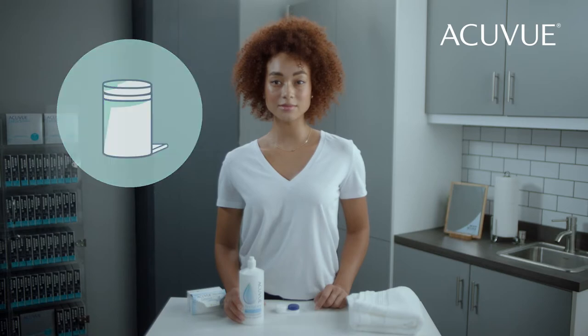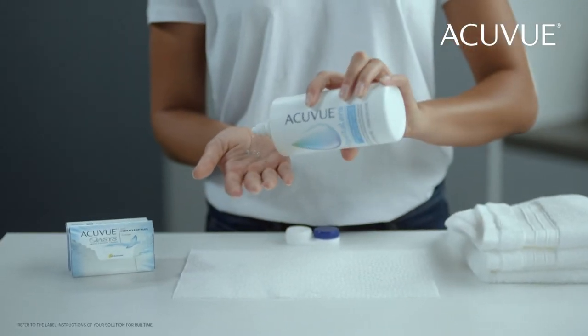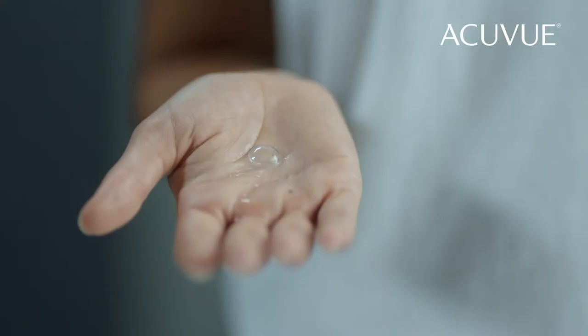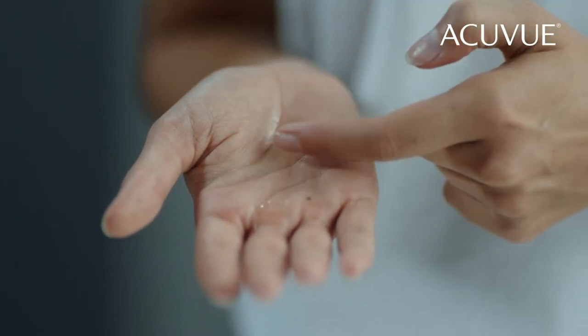If you have reusable contact lenses, clean them by placing three or more drops of solution on one side of the contact lens. When cleaning your contact lens, rub gently from the center to the edges, then turn it over and do it again.